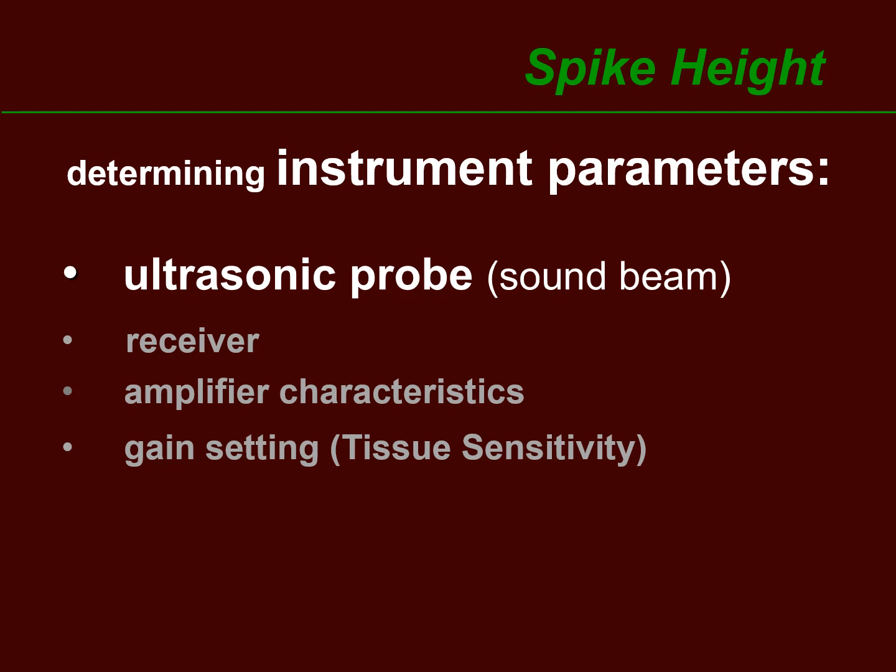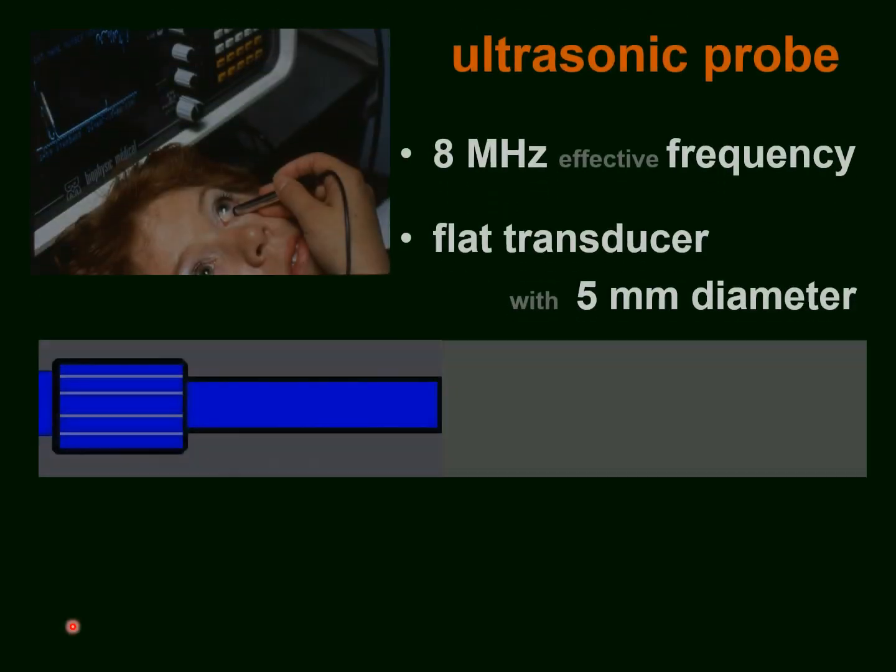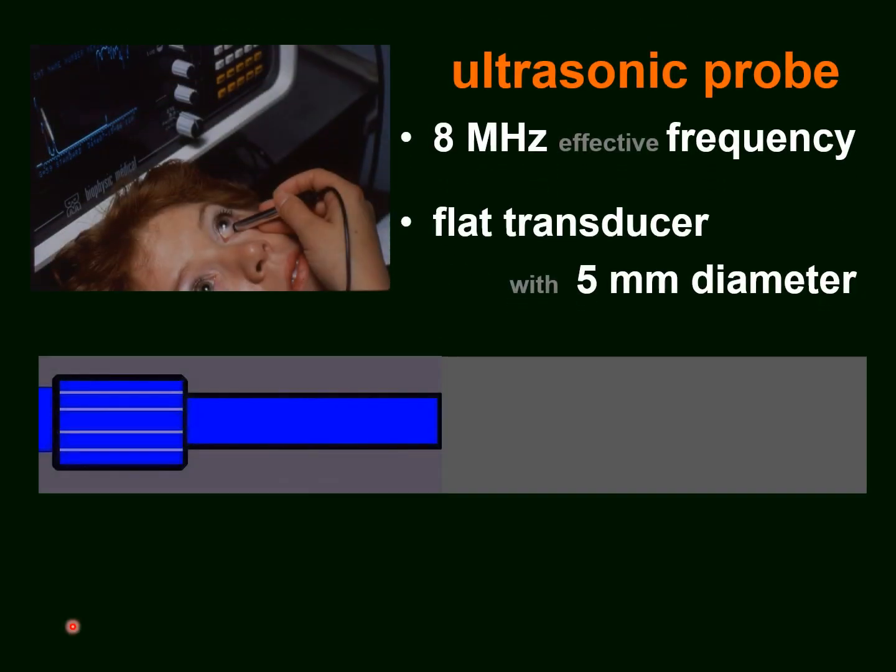At first, we will discuss the ultrasonic probe that sends out the sound beam. The standardized A-scan probe emits an effective frequency of 8 MHz.